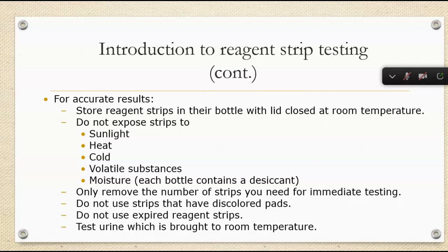For this to be accurate, reagent strips have to be stored in their bottle with the lid closed tightly at room temperature. We can't expose them to sunlight, heat, cold, volatile substances, or moisture. Each bottle will have a desiccant pack. You always need to check the strips to see if there's any discolored pads or they look brown, because that typically means they've been exposed to something and are no longer valid.